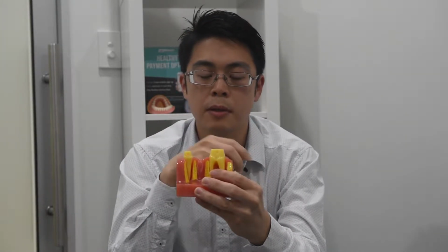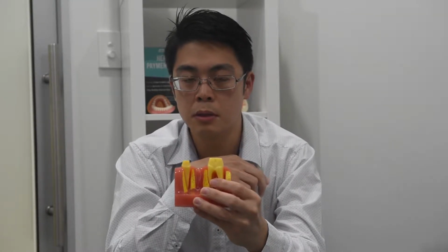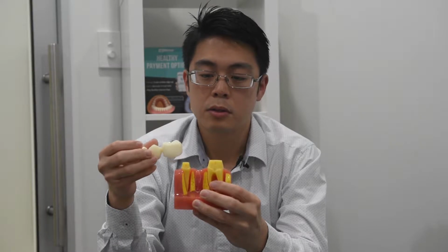So what's the problem with this one? The problem is that because you have to adjust the 2 teeth next to it, it can potentially cause these 2 teeth to have further trouble because of all the adjustments that we have to do onto the teeth next to it.